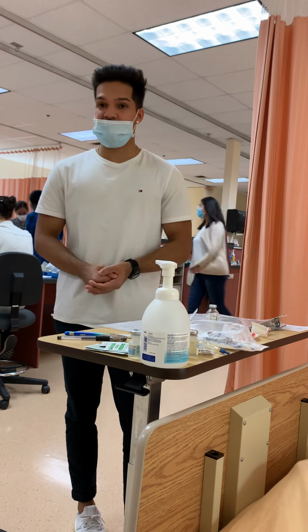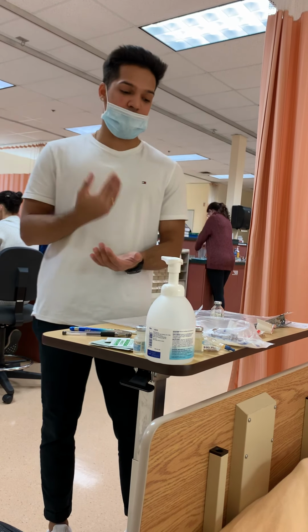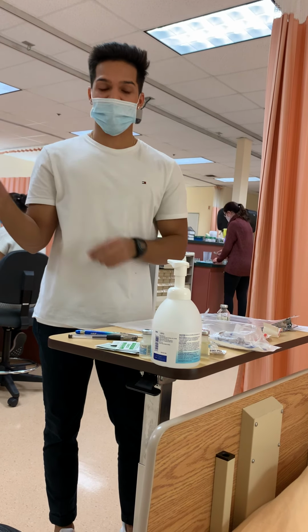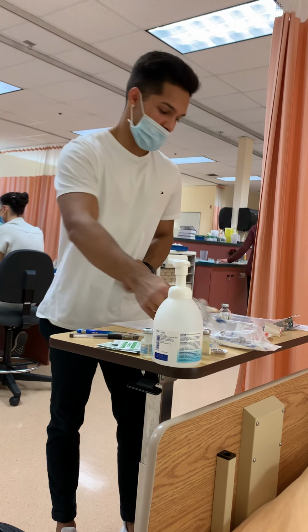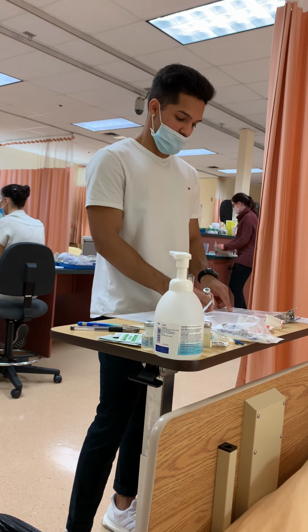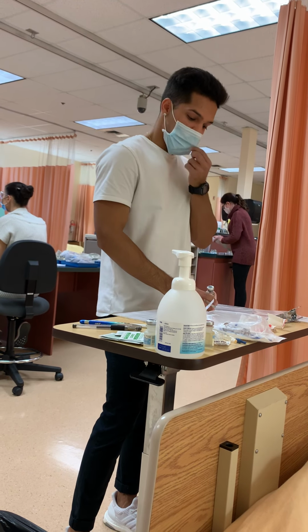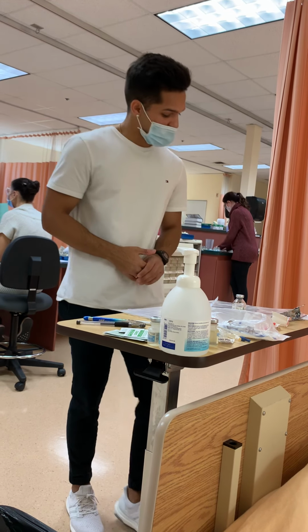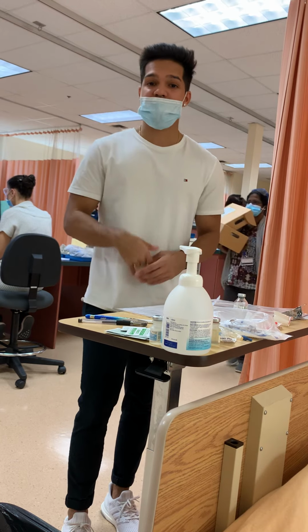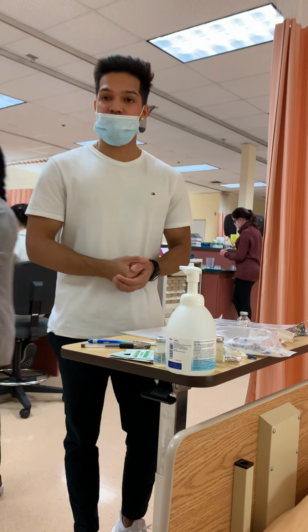I will be administering that over 60 minutes because it's my patient's first time getting this medication, and that's also why I'm diluting this in a bigger bag, rather than 50 mLs, so it doesn't irritate my patient. I do see it is compatible with normal saline, so that's good to know. Some potential hazards with my medication can be diarrhea, nausea, and maybe a hypersensitivity reaction, so I keep those in mind when I do my patient education.